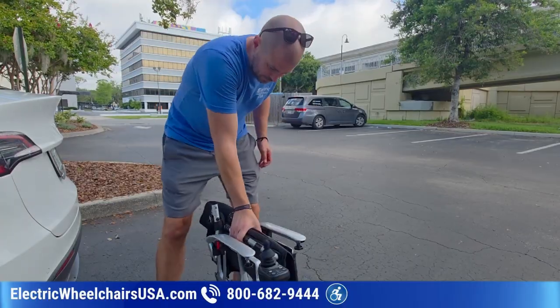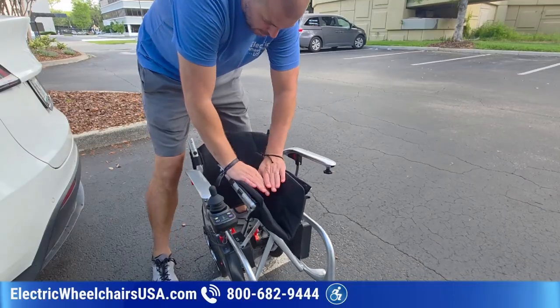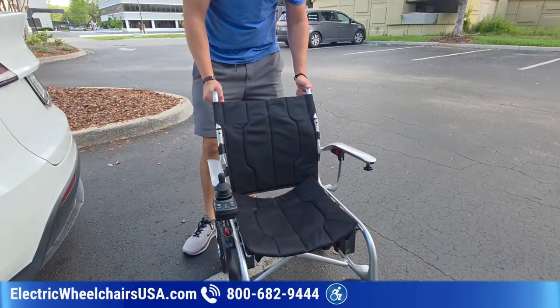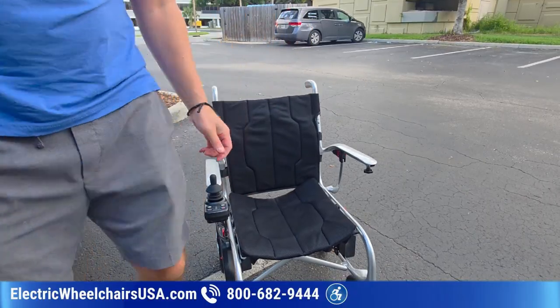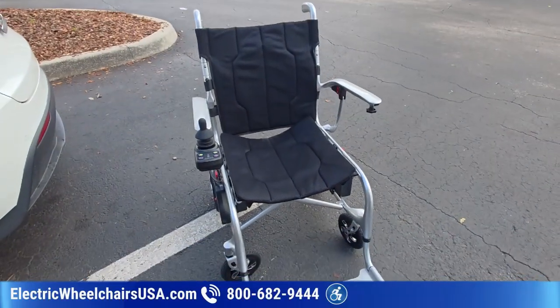how to unfold it. So the first thing you do is just press down the middle, because it folds sideways, and just unfold it that way. You lift the seat back up and you'll hear those 2 clicks, and that puts the handlebars into place. Put the footrest down and you're ready to go.